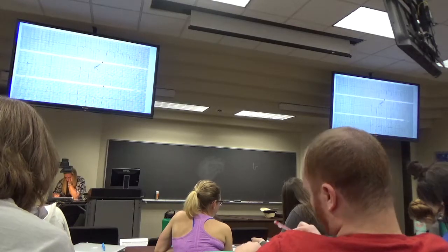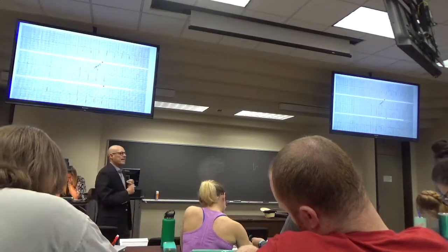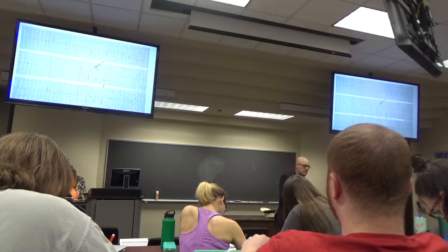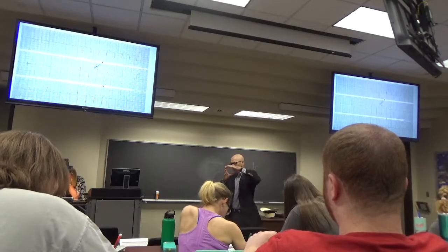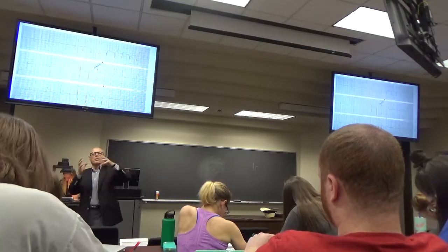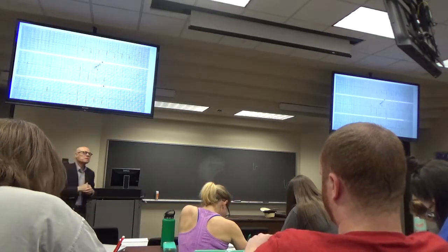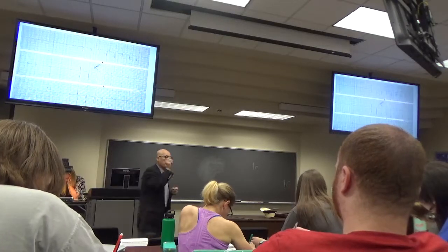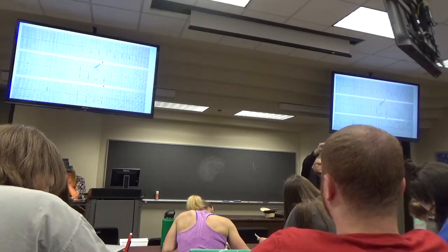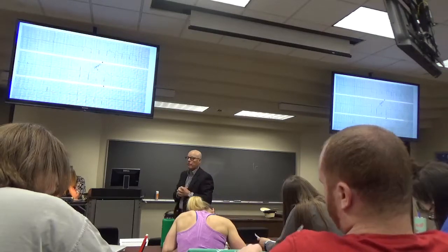It's important to pick up left ventricular aneurysms because they can be the site of arrhythmias. They can be irritable and they can be the site of arrhythmias. If they're big enough, they can be the site of blood clots. Blood clots can form up in that aneurysmic bubble, if you will, and cause strokes. So being on the lookout where there are Q waves for elevated ST segments and upright T waves is a good thing to be looking for aneurysms.